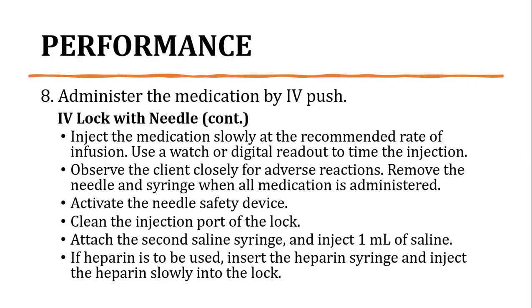Activate the needle safety device, which is gamit natin is the scoop method para po maiwasan yung pag-puncture sa skin natin kapag ikakap yung syringe or the needle cap directly gamit yung kamay. Clean the injection port of the lock to maintain the sterility of the procedure.